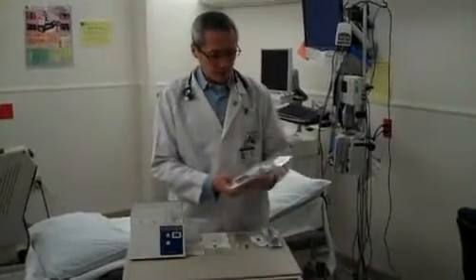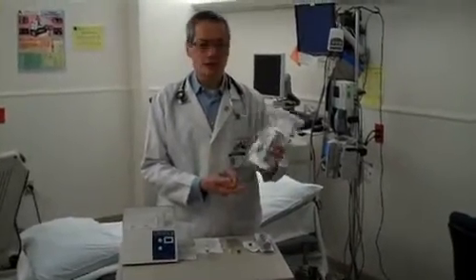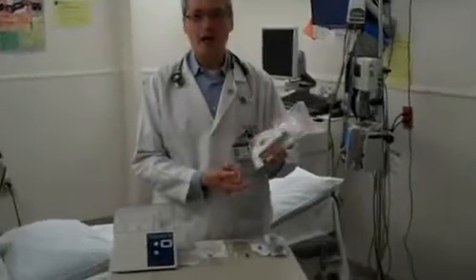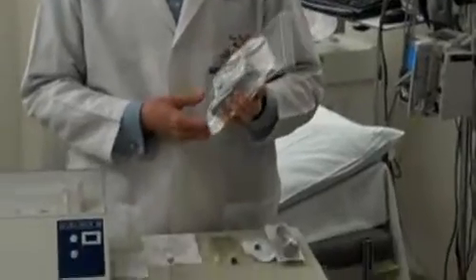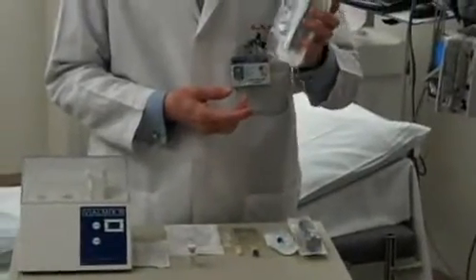At OHSU, we generally make up these little plastic bags where we just put all of these components so that they're easily available whenever we need to do a contrast-enhanced study — we just grab one of these kits.